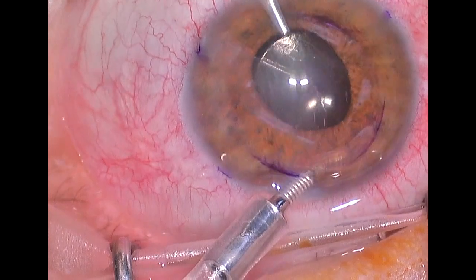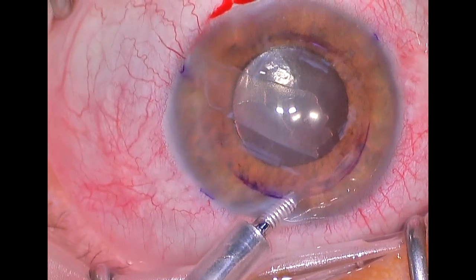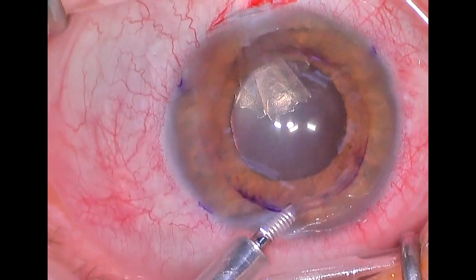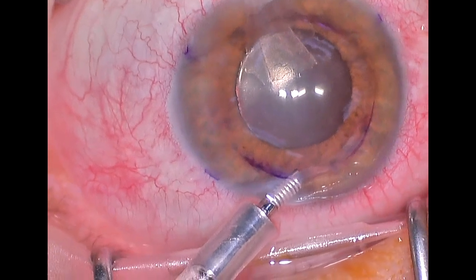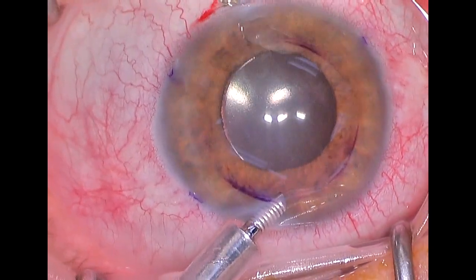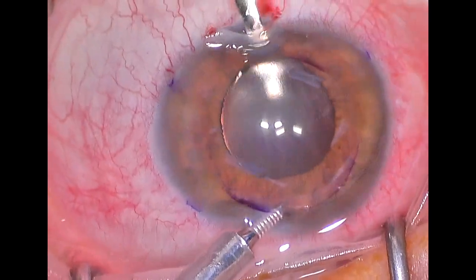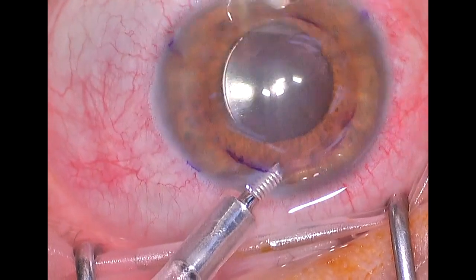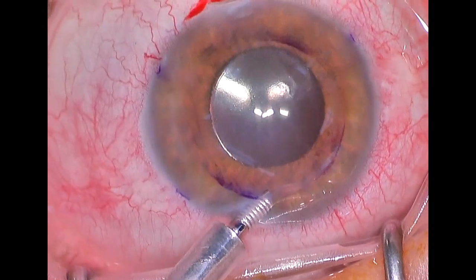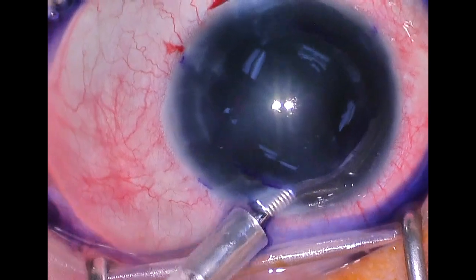Once the scroll has been removed — and sometimes it's a little hard to grasp — we then use trypan blue dye to stain the internal portion of the cornea to identify any pieces of endothelium that may be remaining. We want to create a really centrally clear area free from all the old tissue so that there is a nice clean space for the new tissue to be transplanted and so that it can heal properly.